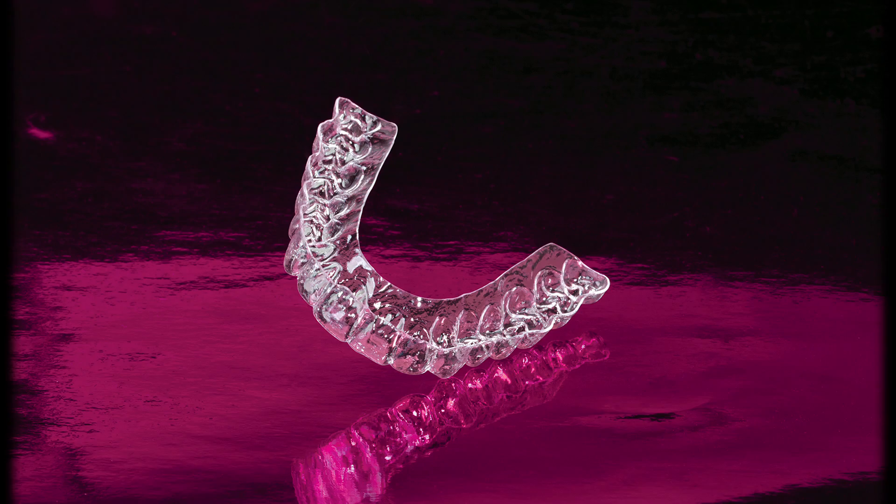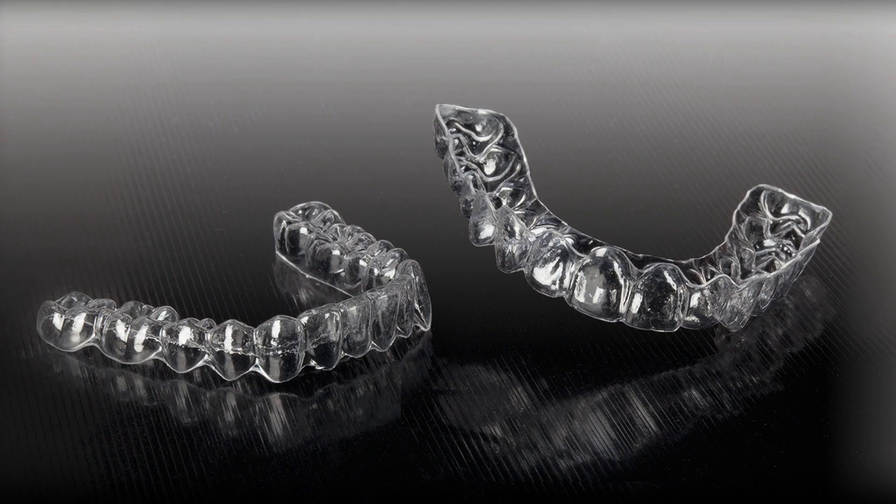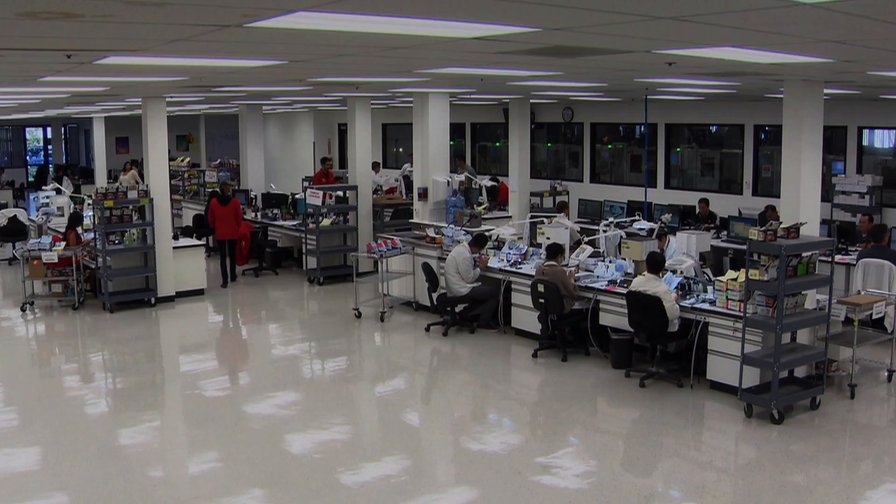Here at Glidewell Laboratories we offer Clear Lock retainers for life, which are BPA free and one millimeter thick. They come with the option to digitally store the patient's models for 30 years, all for one flat price. Let's take a look at the process we follow here at Glidewell Laboratories.